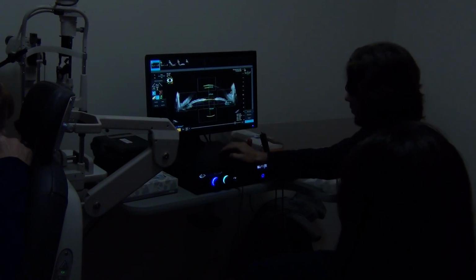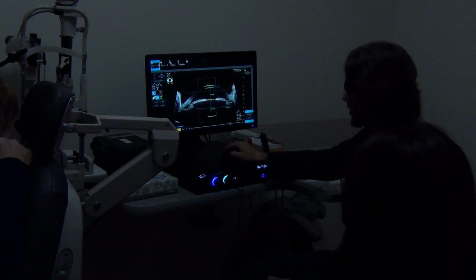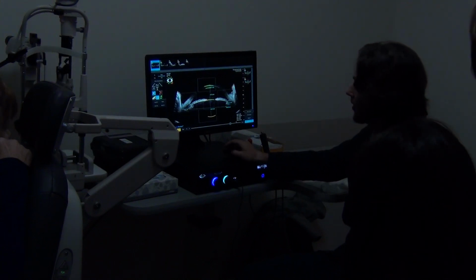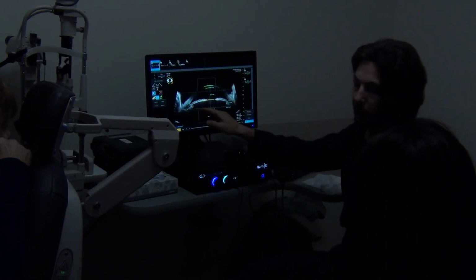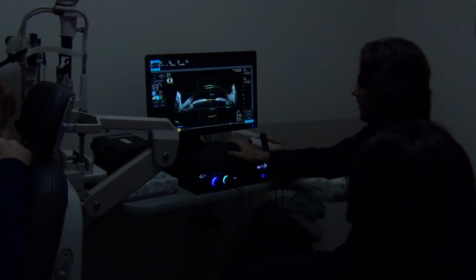Then we can go another frame, see maybe we'll have a better image somewhere. Let's say this one, right? Again, I will move this line. This one will go here. This one will go over here. 10, 11. So very similar, right? So I saved the frame as well. Nice. I didn't know about the eye tracking software. Yeah, so it's helpful. Honestly, the more you do it, the less you will need that eye tracking software. It does help because it provides you instantly so much data and the numbers. Absolutely.